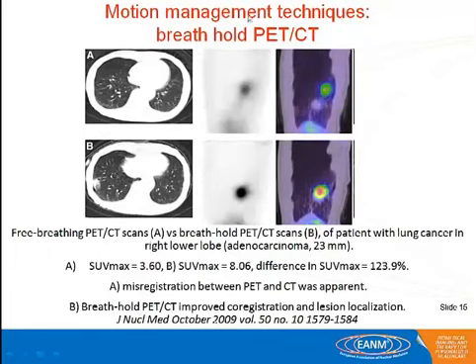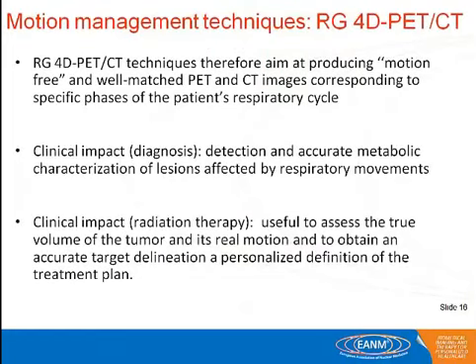Well, breath-hold PET-CT, as you can see, is a case that was made in Sweden. You can see the difference when having a breath-hold CT. The misregistration was really huge before, and now we have quite a better example. Okay, we are not against breath-hold, but it's only for some particular cases. Actually, we don't want to use it in the department. I wanted to show you why, because it can be used in some situations.